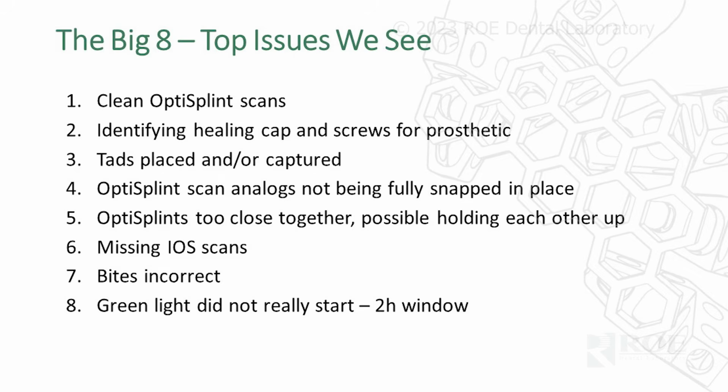When I go and talk to our designers, I say, "What's the number one problem?" They go, "Well, it's the quality of the scan." Because you can imagine if you're in implant dentistry, if your team or someone did not scan a scan body at all or very well, you can't register it, and the patient's coming back.